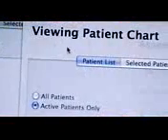So you'll see graphical charts for sucks per minute, sucks per burst, bursts per minute, suck pressure over time. These are all important parameters for a clinician to see and observe during the therapy. Based on these parameters, the clinician can make their own assessment on when that patient is ready to transition to oral feed.